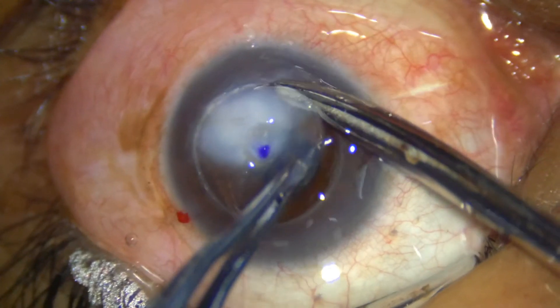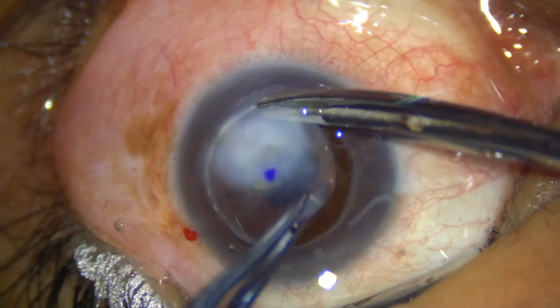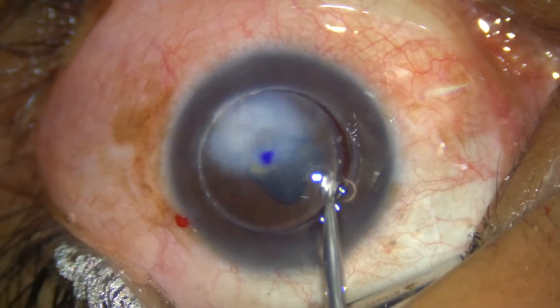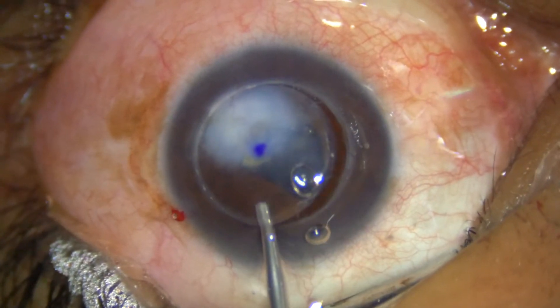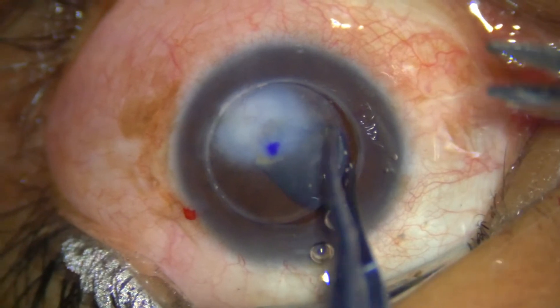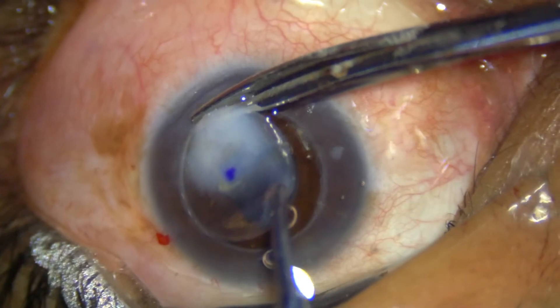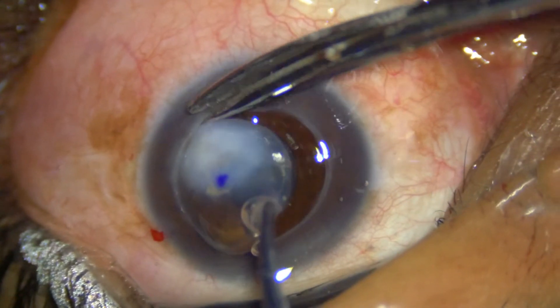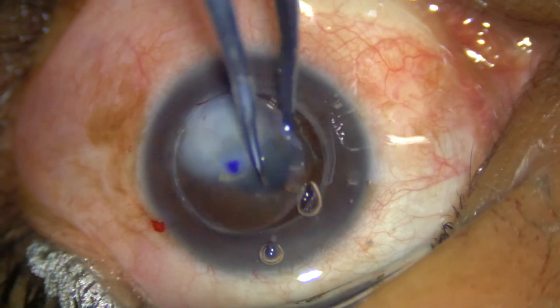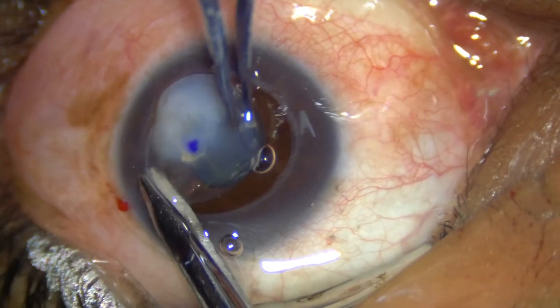Just take care that you have made the trephination 360 degrees with the same depth, so that while cutting the rest of the area with scissors it becomes easier and the margins are quite sharp. The first modification I have made is injecting a viscoelastic substance in the anterior chamber to ensure good trephination depth in all directions and give good margins.